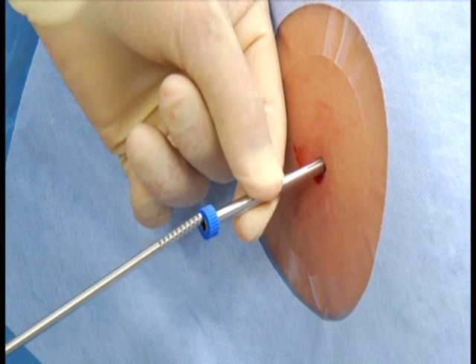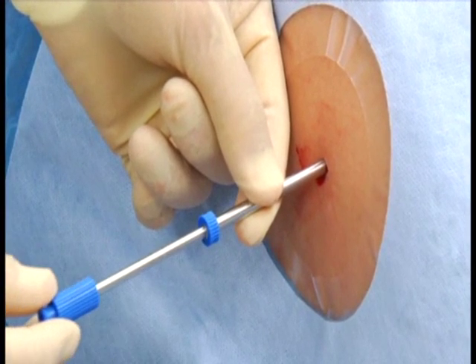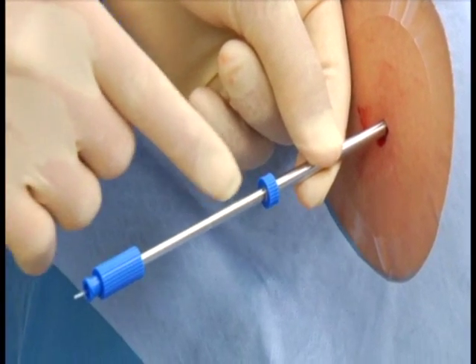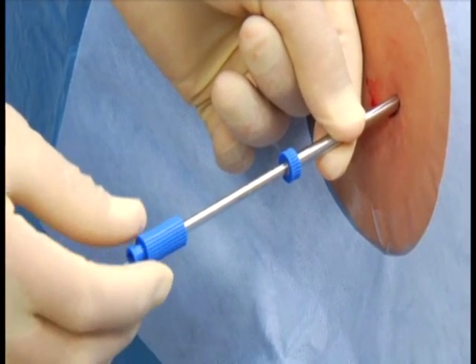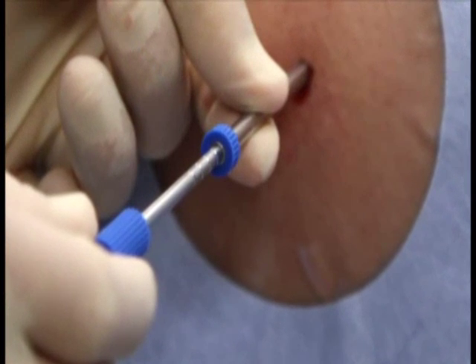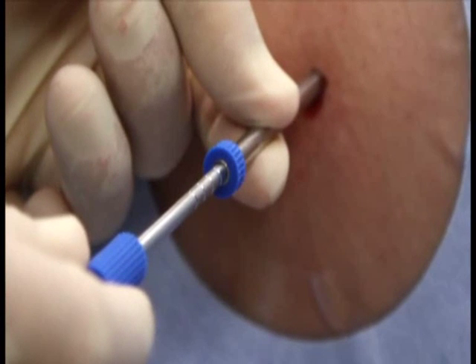Insert the receiving needle into the cannula down to marker 1. On the spyrotome, observe the marks on the receiving needle. Marker 1, the first large mark most distal to the handle, indicates the starting position. Marker 2, the second large mark most proximal to the handle, indicates the full length of the helix in the tissue. The three smaller marks in between are 5 millimeters apart.